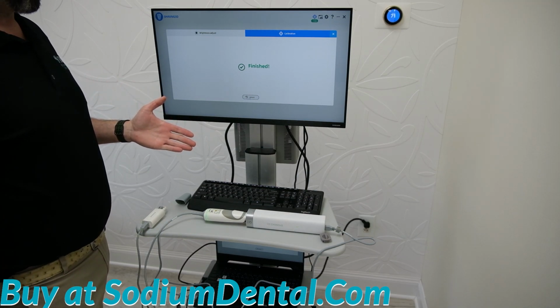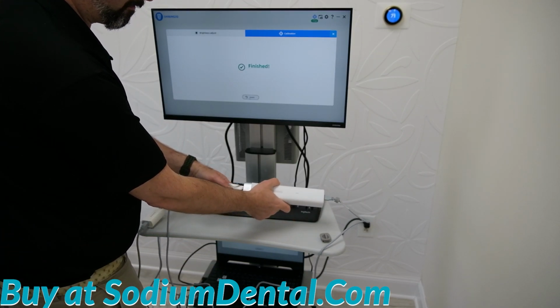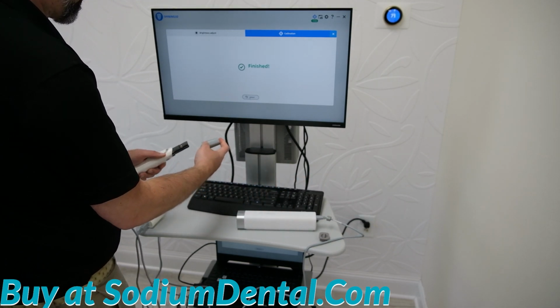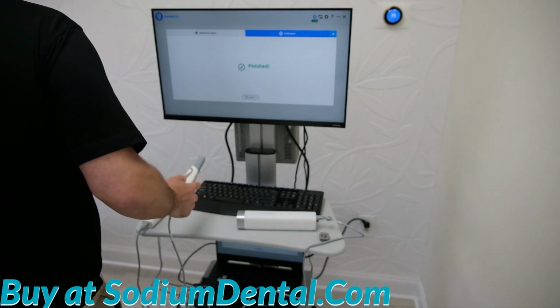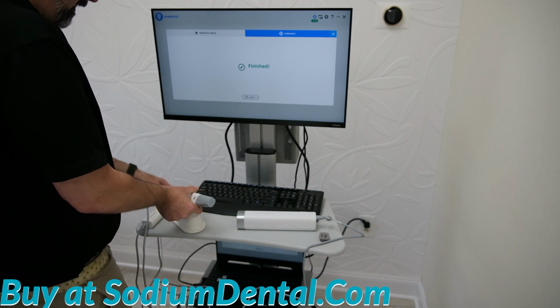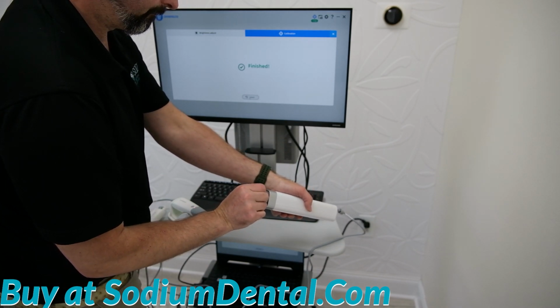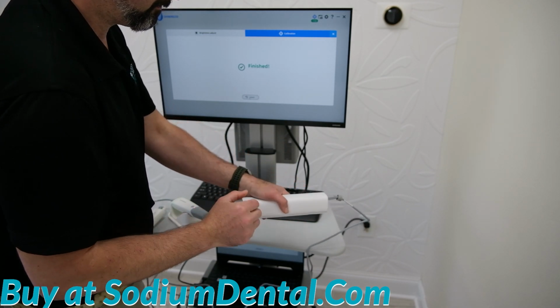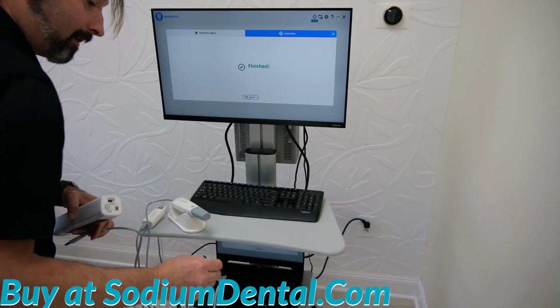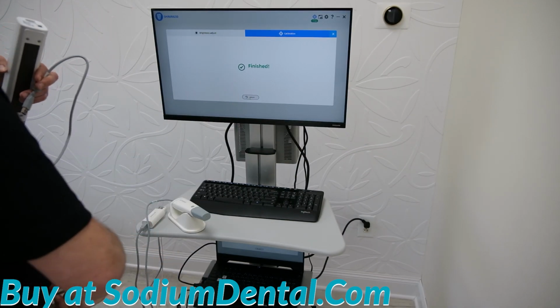Now your calibration is complete. Carefully remove your scanner. Put its dust cover back on. Return it to your scanning cradle. Put this dust cover back on. Unplug. And you can put these cables back away in your kit for when you need them a month from now.